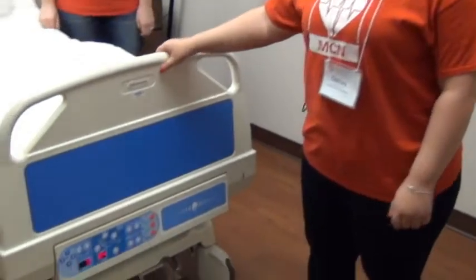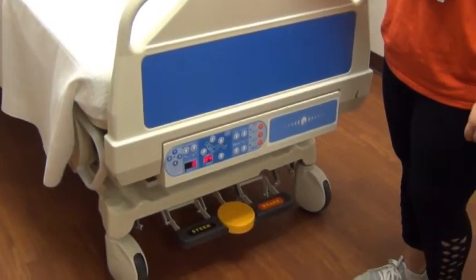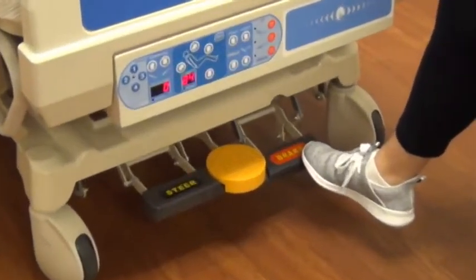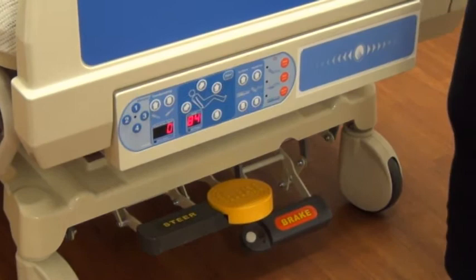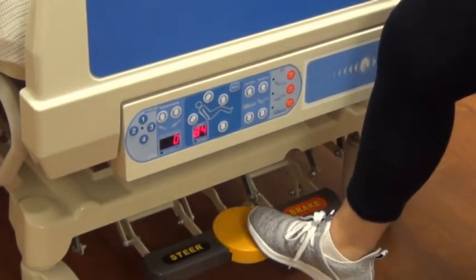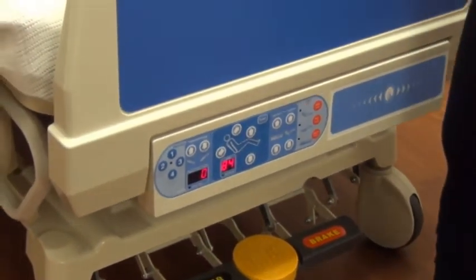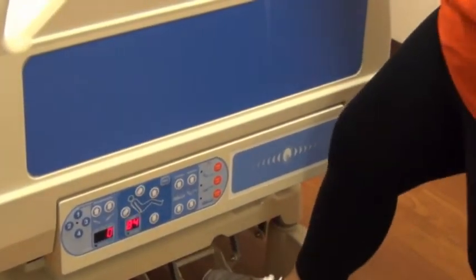Safety is a very important factor when caring for patients. Going into a patient's room, there are many safety checks that you want to do. The first one is checking the brake. Right now, our bed is not locked and it could easily move. So in order to engage the brake, put your foot on the brake and press down. And now our bed is locked. If you want to release the bed to move it, put your foot on release and push down, and now our bed is unlocked. But you always want to make sure you engage the brake.